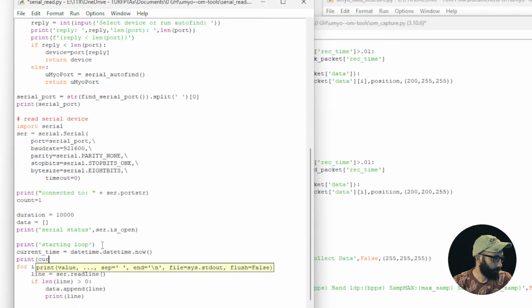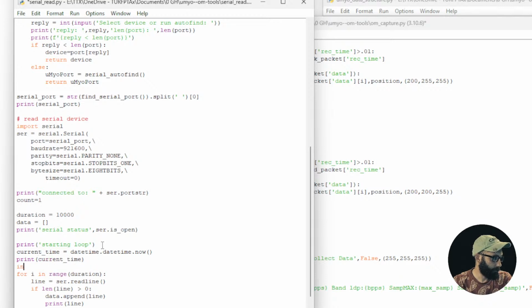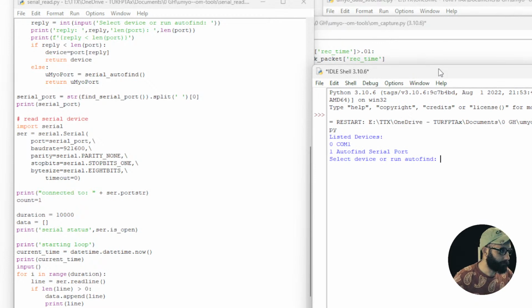Print current time and then input. So we'll F5 that. It's going to ask which device. Oh, it doesn't have any of them listed, so we need to plug it in. Oh my goodness. This is why I can't have nice things. There we go. Work smart, not hard, they say. Okay. Now I have that set up there.